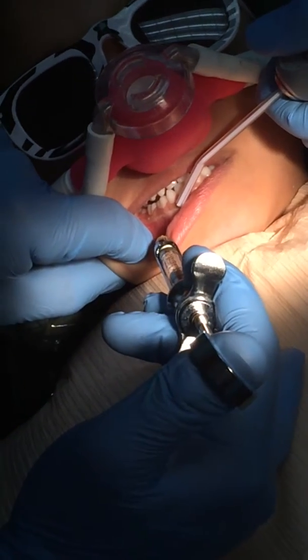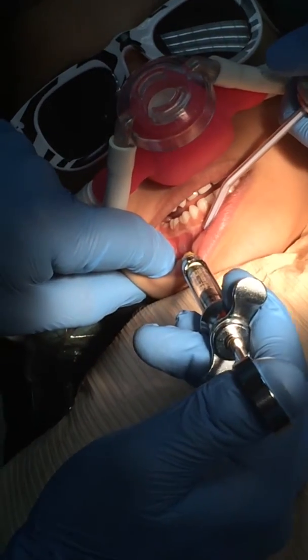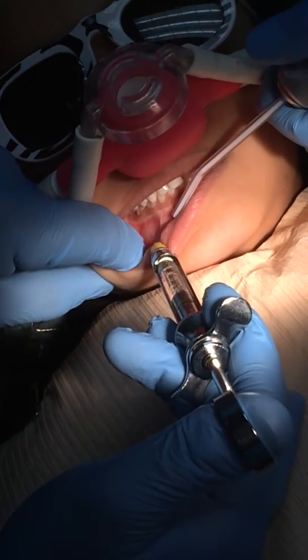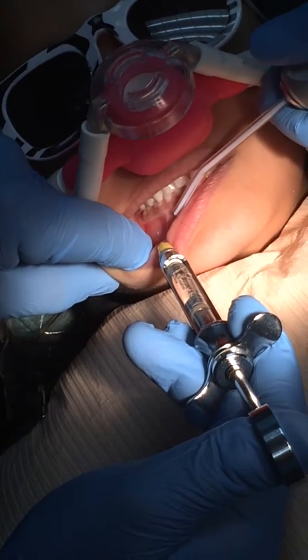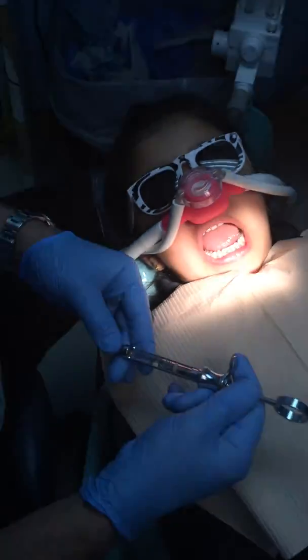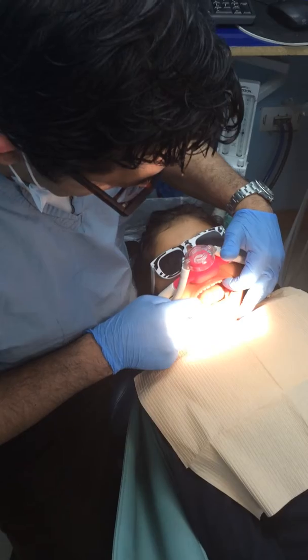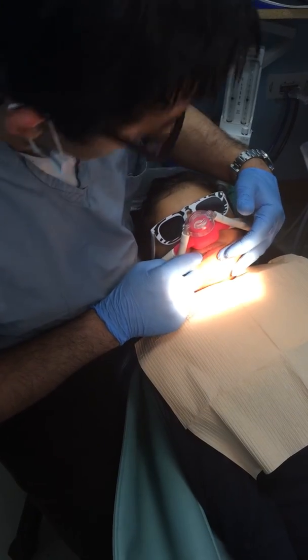The air is almost like shaking the tissue, except we don't have to do it manually. Bite down for me — give it as slowly as possible. I'm using septocaine here, 4% septocaine with a 33-gauge tip. For this entire upper right and lower right quad, you end up giving just less than half of the carpule, which should be more than sufficient to do our restorations — in this case a stainless steel crown and a DO restoration on the bottom and top respectively.